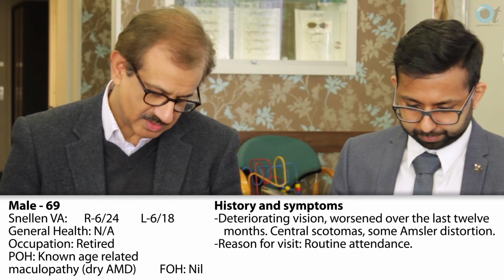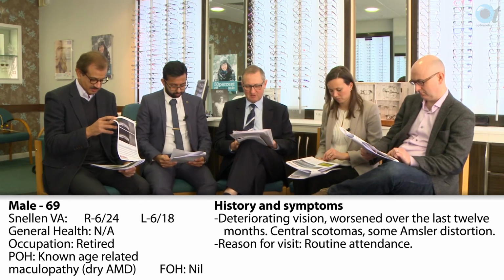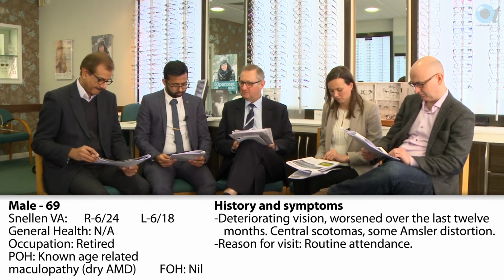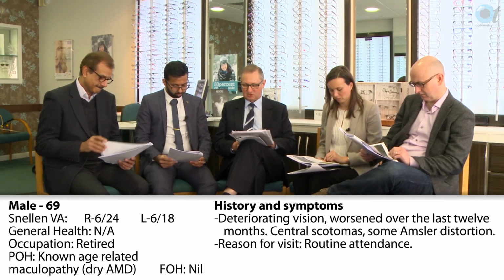But the other thing is that over here on the OCT we've got a line OCT, and there is a possibility with deteriorating vision that there could be a wet element here, and perhaps a more extensive OCT may be a better idea. Okay, is there anything in the images that are provided that might make you suspicious of that?